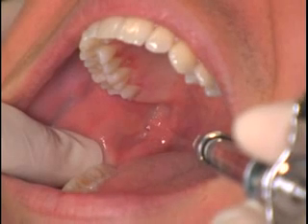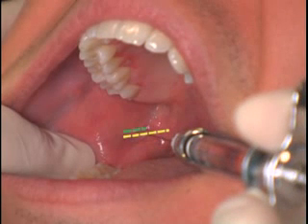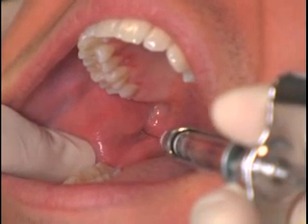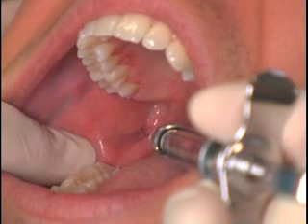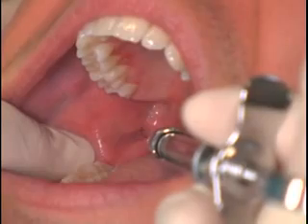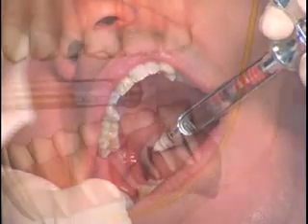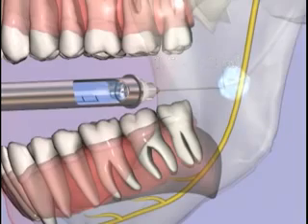The needle tip is then moved half the distance toward the coronoid notch and then half the distance back toward the raphe. This locates the injection site, which is 3/4 of the distance from the coronoid notch to the raphe. The needle is then inserted and advanced slowly until bone is contacted. The average depth of penetration is between 20 and 25 millimeters, which is 2/3 to 3/4 the length of a long dental needle. Once bone is contacted, aspiration is performed twice, and if negative, 1.5 to 1.8 mLs of local anesthetic is administered slowly.